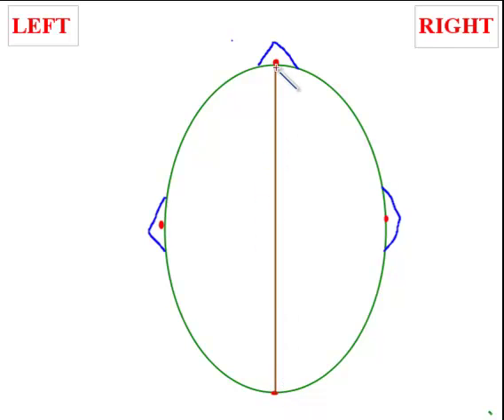The measurement from nasion to the inion is taken, and the midpoint between these two landmarks is placed here.